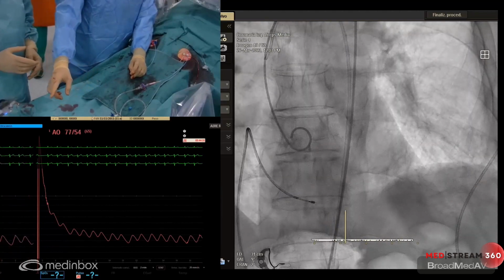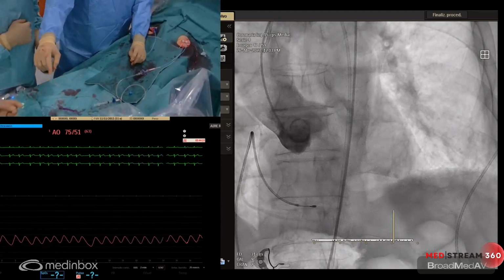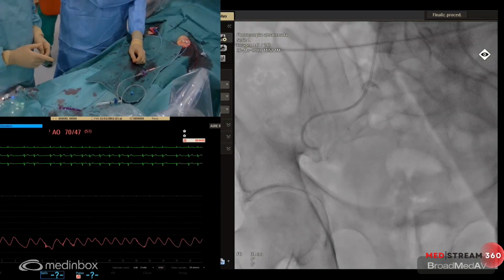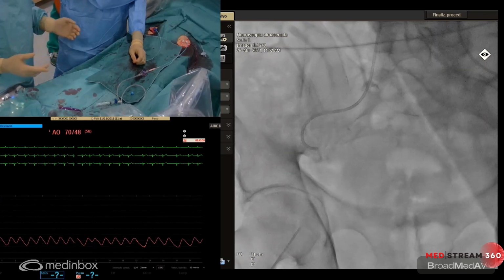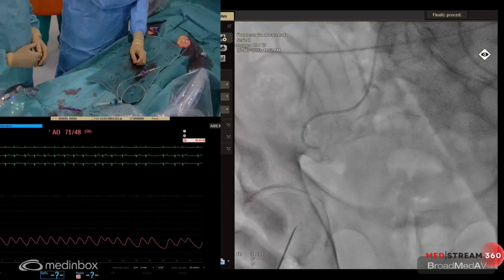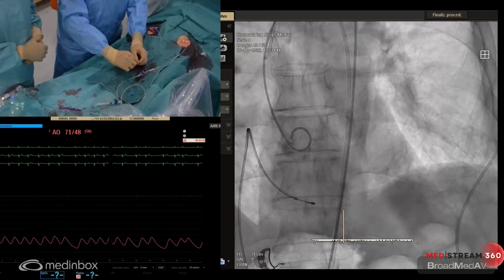proximal aorta. What we have done up to now is we have punctured; we are going to implant the valve through the right femoral artery. So we have chosen the left femoral artery for contralateral. Here you can see how we have filmed the iliofemoral arteries, very good for transfemoral approach. Here you can see how Santiago Jiménez Valero has punctured the right femoral artery. We use for protection purposes a contralateral 018 wire.